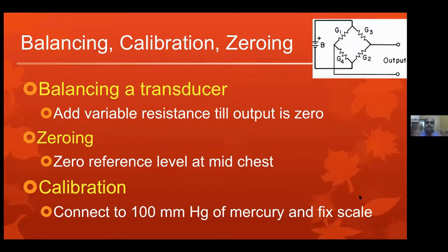Heart failure means left ventricular end diastolic pressure. Left ventricular end diastolic pressure is detected at 5 centimeters below the surface of the chest at the fourth intercostal space. That is the reason why the recent references are all 5 centimeters below the surface of the chest, because the left ventricle is given priority. If you are a congenital heart person, centric on everything, right heart, left heart, go by the 0 mid-chest level.